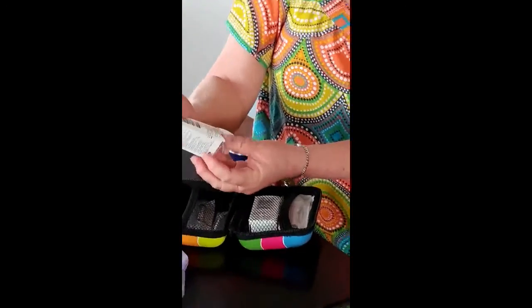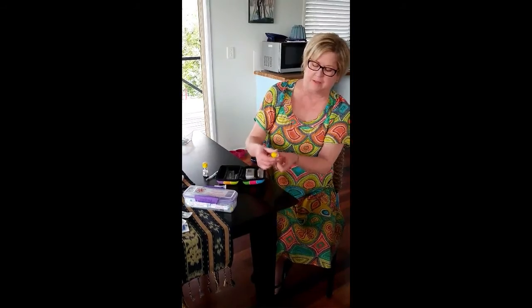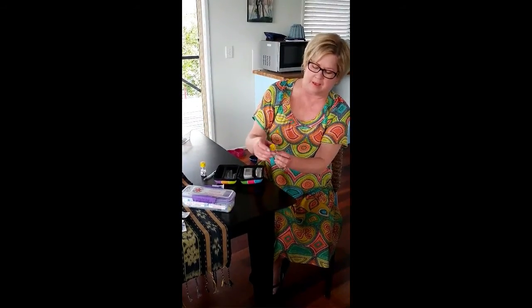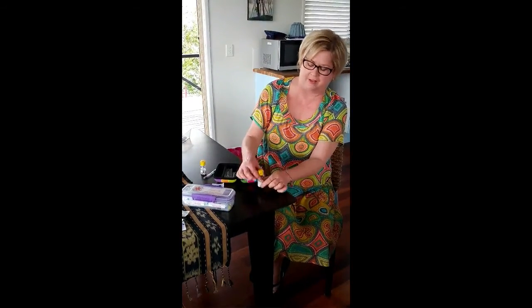First of all, I'm going to demonstrate how you push down on the actovial. It comes like this with a little cap on the top and a little rubber stopper. The powder is in the bottom and the saline solution is in the top. Using the heel of the hand on a solid surface, you push down hard and it dislodges that rubber stopper, then just swirl it around until it dissolves.